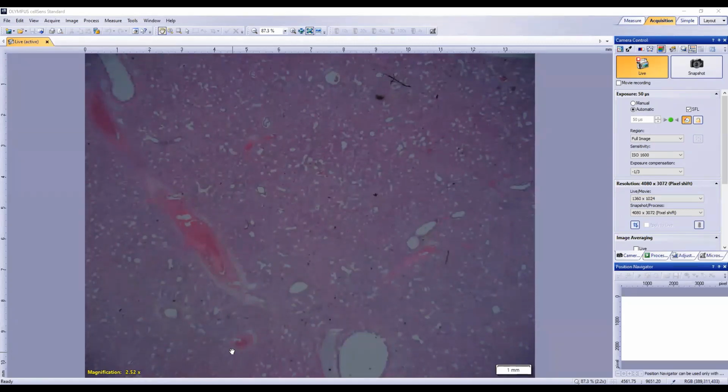Then moving inward, in the mucosa and submucosa of the bronchi and bronchioles, they should be fairly intact unless there has been edema or infiltration of inflammatory cells.